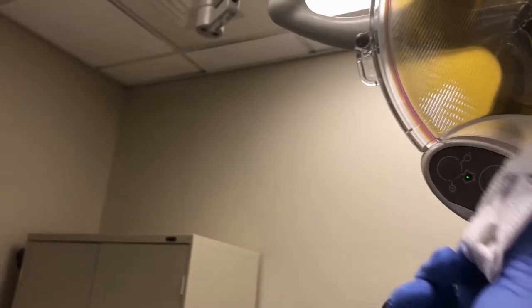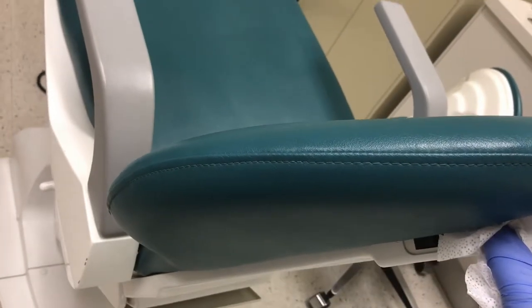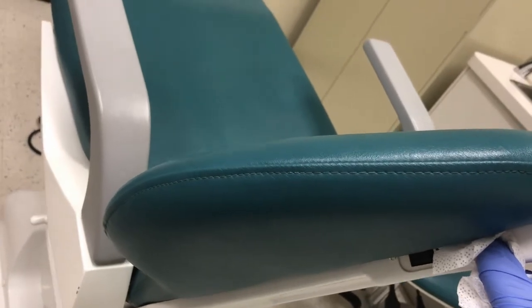Once everything has been disinfected, raise the patient chair up into the highest position. This will indicate to other dental team members that the operatory has been cleaned.